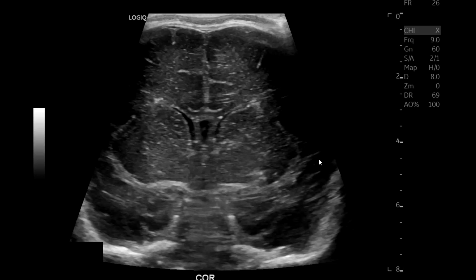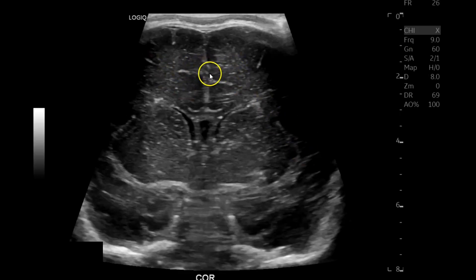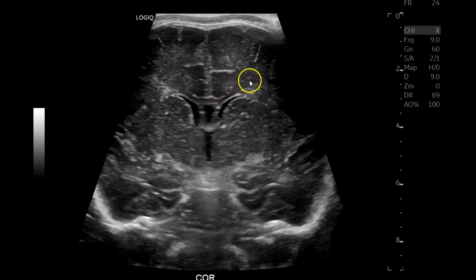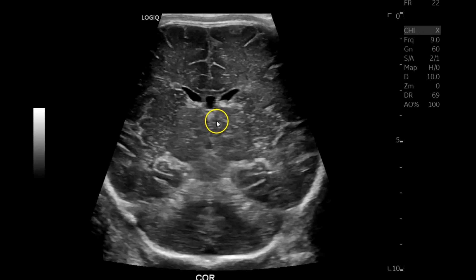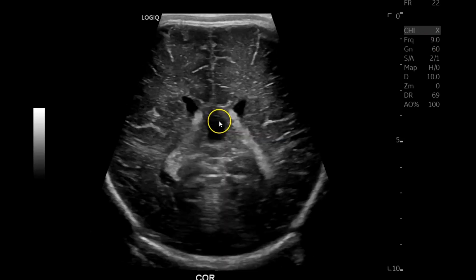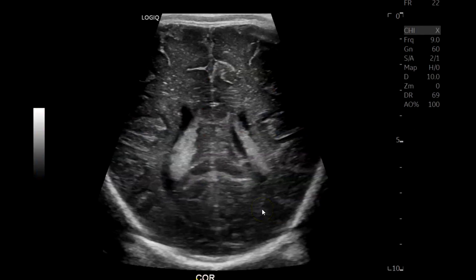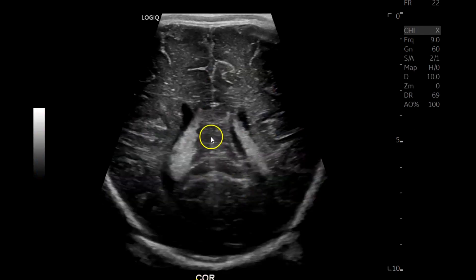Then I pretty much repeat everything with the new linear probe — the new nine. The old nine was a 9L; this is the L29, and I'm scanning at a frequency of nine. The images are just fantastic. I raise the TGCs a little bit — see that difference. Choroid plexuses are normal.